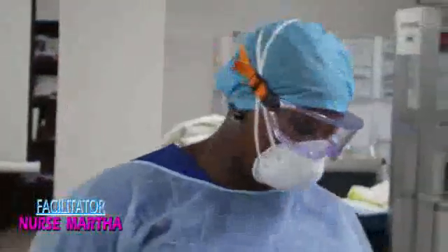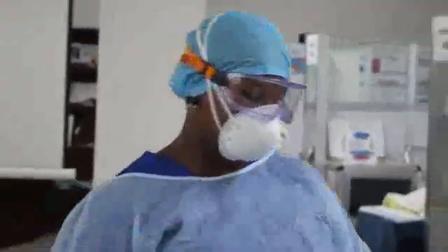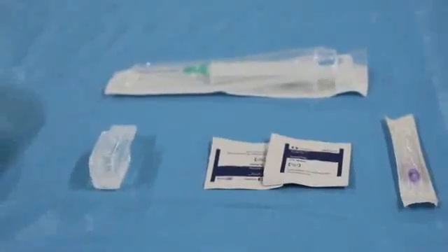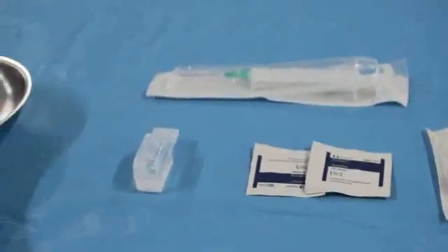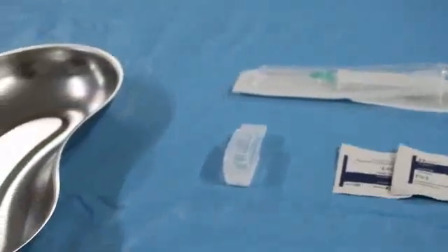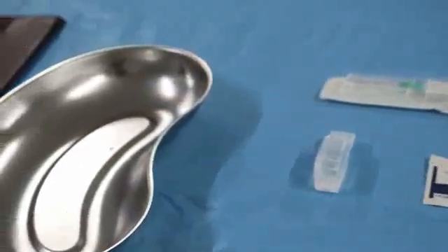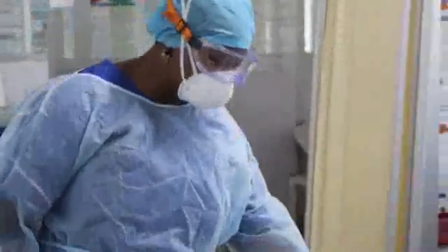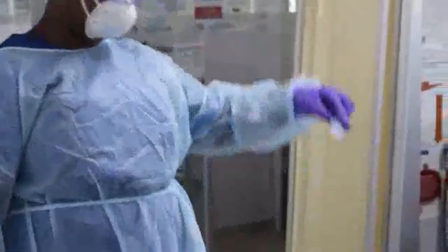I'm Nurse Martha. This morning I have a nursing procedure to carry out on my patient. I'm going to give my patient injection morphine. For me to do that, I have to assemble my equipment. This is a trolley, a medicine trolley. On top of the medicine trolley, I have my kidney dish. I have the injection morphine.